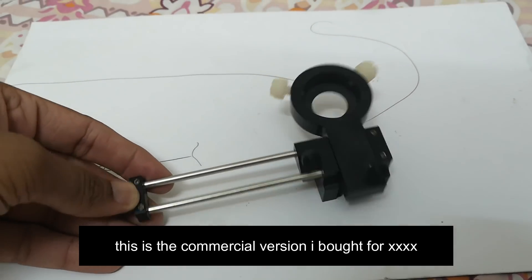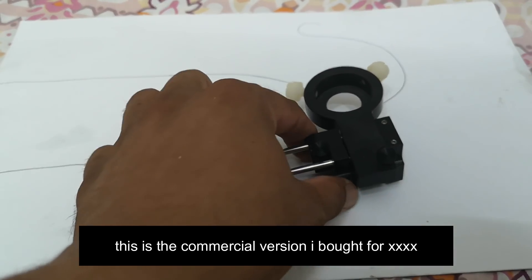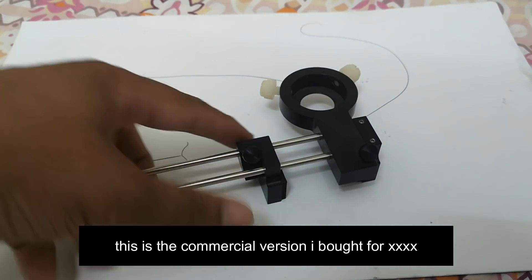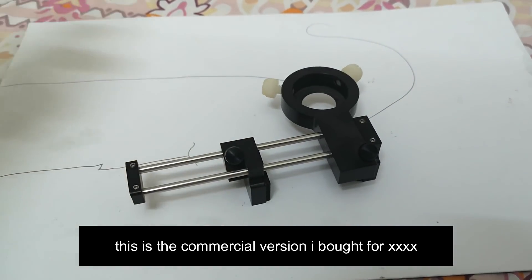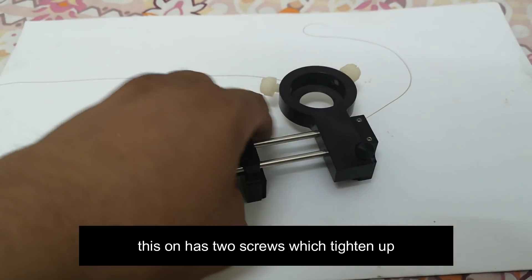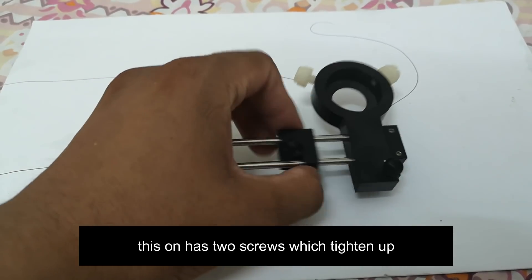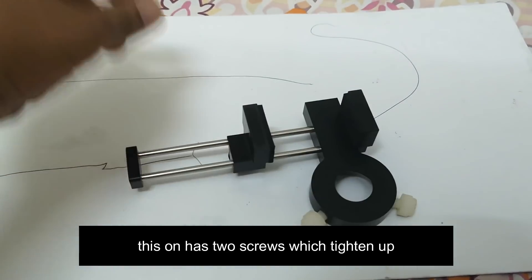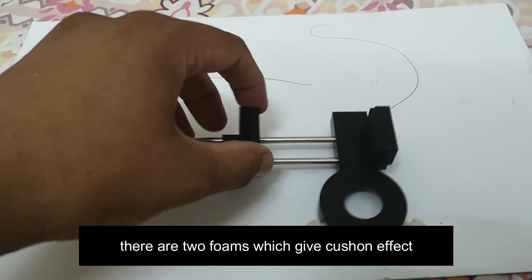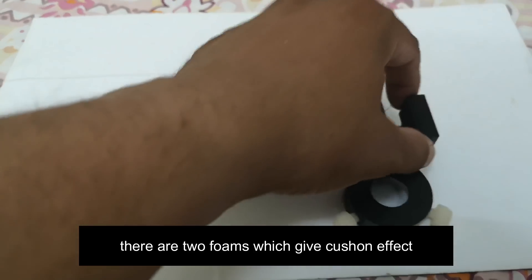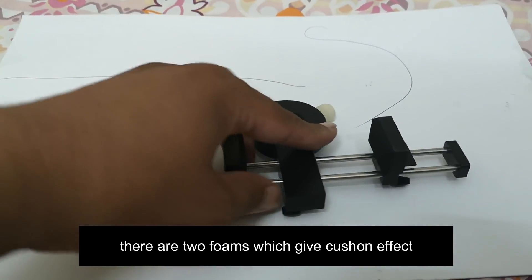This is the commercial version which I bought for about 100 pounds from internet and got it delivered to me. This has two screws which tighten up and there are two foams attached to the ends which give a cushion effect to the phone.